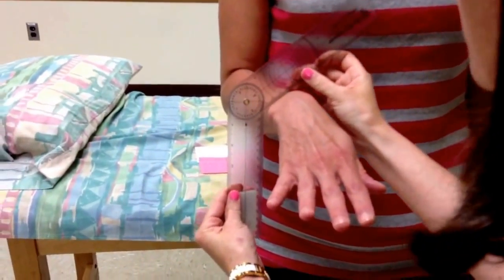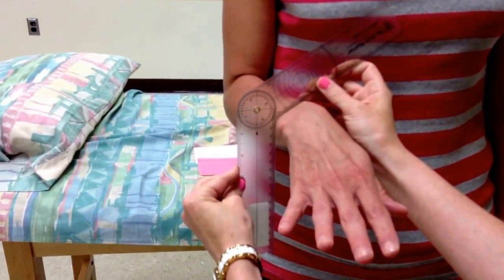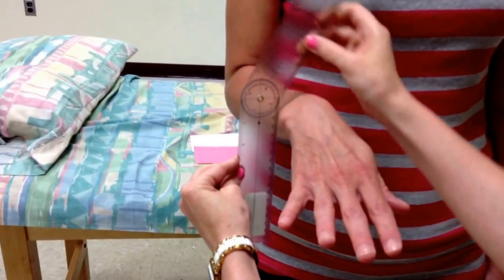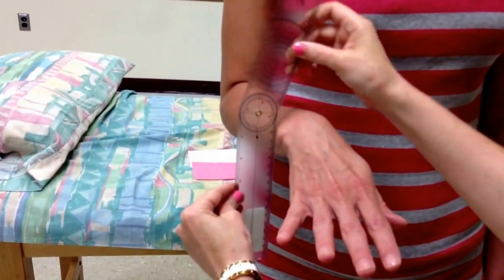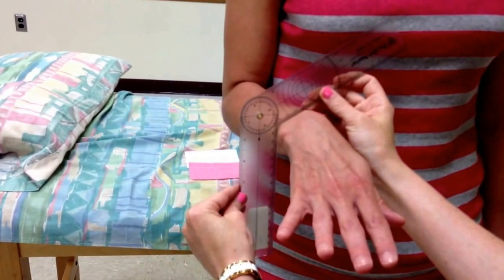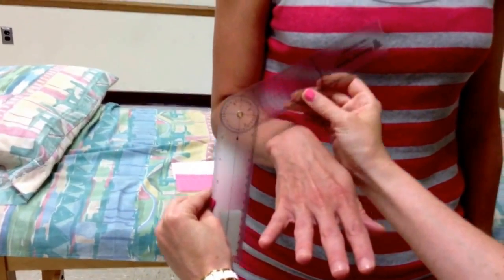The moving arm is going to come across and be equally distributed across the dorsal aspect of the distal radius and ulna. You can see where we're starting on the goniometer, and it ended up at about 60 degrees of pronation.